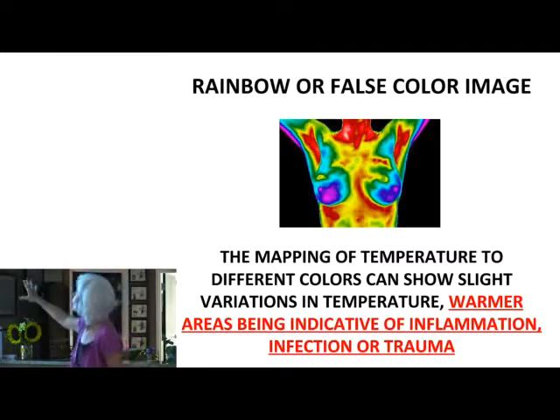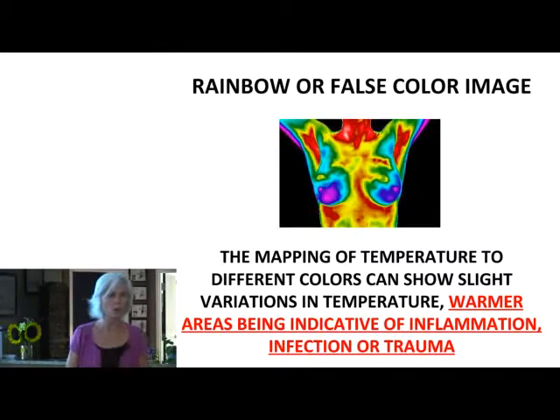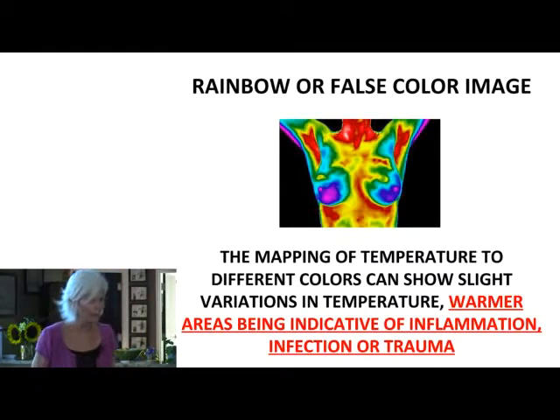And the whole idea is to alert women about areas of heat within their breast so they can do something about it. Unlike these other screenings, when it shows up, it's there. What we want to do by picking up heat, which is indicative of inflammation, is pick it up before it has an opportunity to form a structure that's going to show up in another screening. Does that make sense? Mm-hmm.